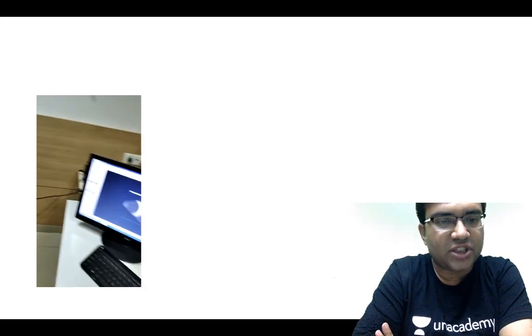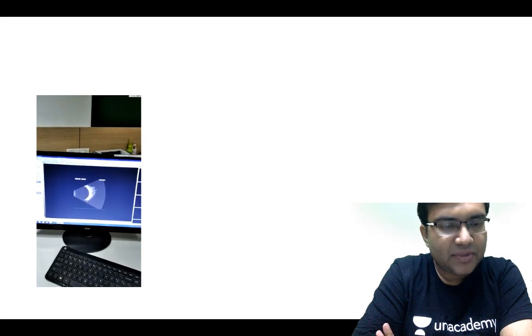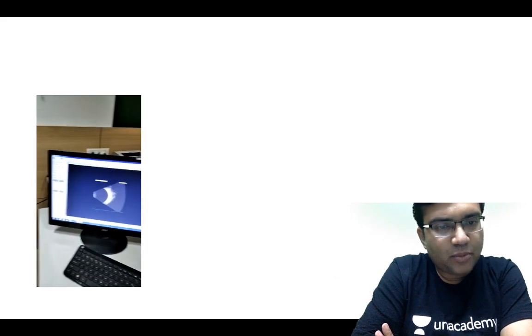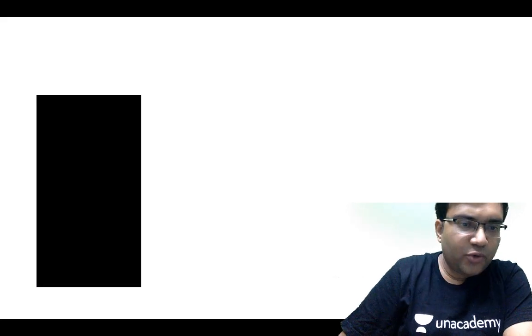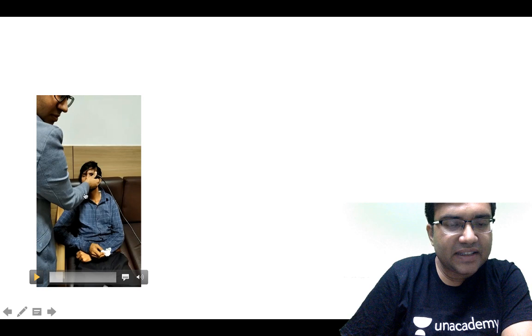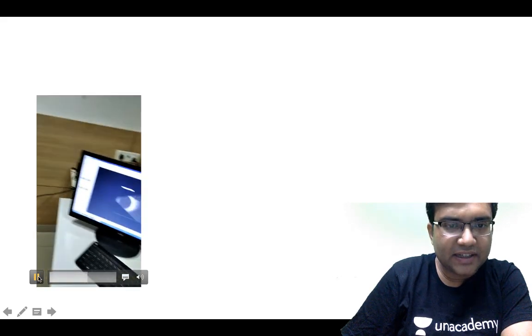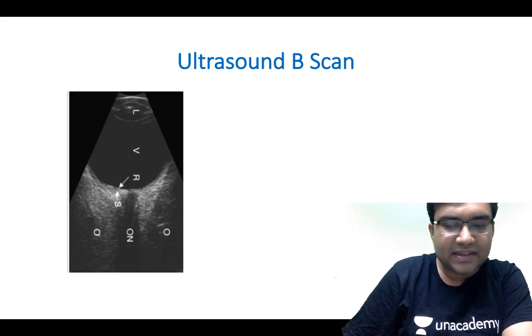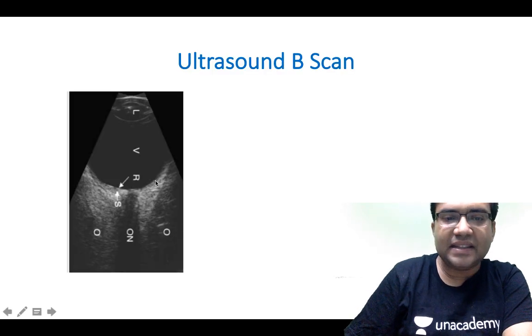Before I start the session, please see how the ultrasound B-scan is done. Usually we keep the patient in a supine position, but here I am doing it in a sitting position to show you. I have put the probe over the closed eyelid with jelly, and with this probe I am scanning the eye.